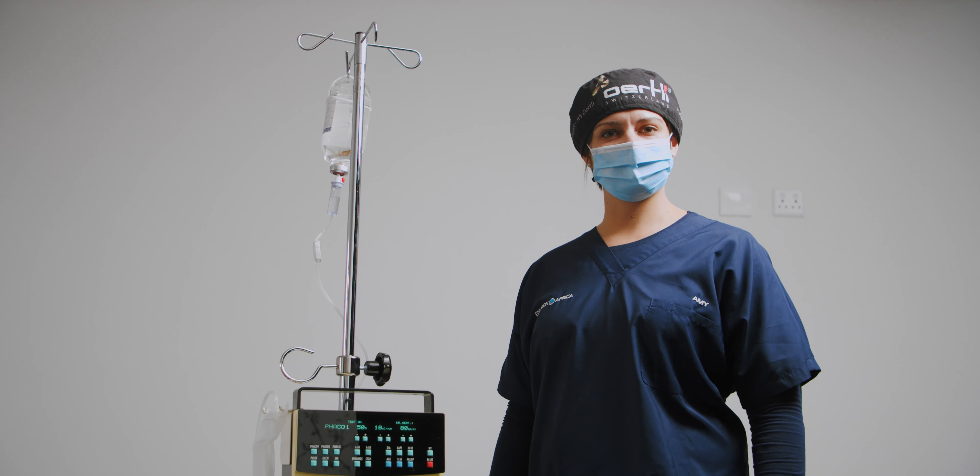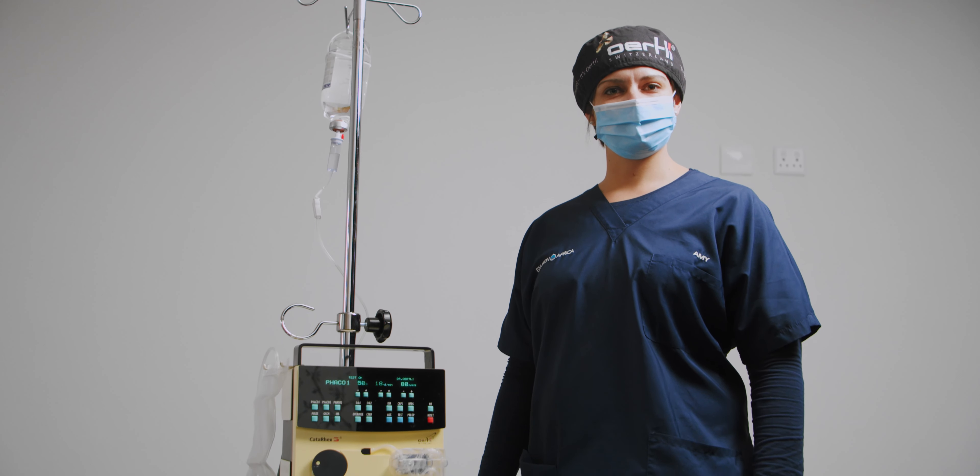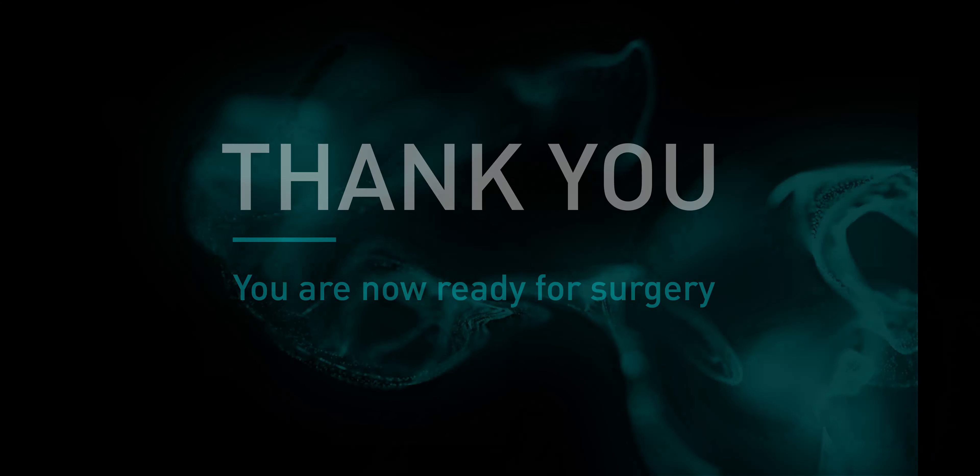Please remember that this is a basic guide for setup. Refer to the CataRhex user manual for complete instructions. Thank you.